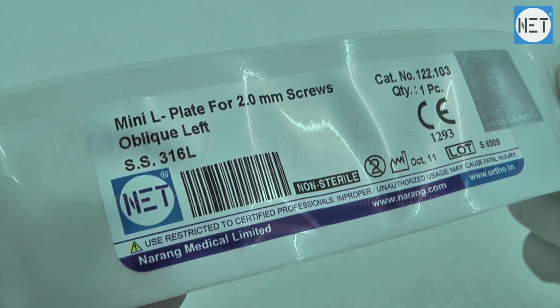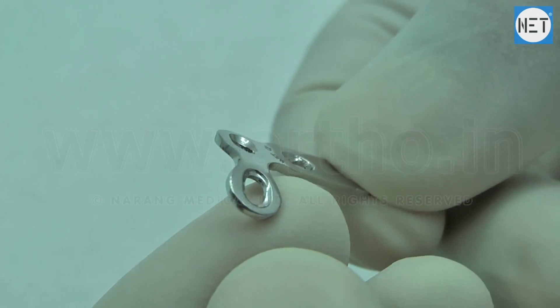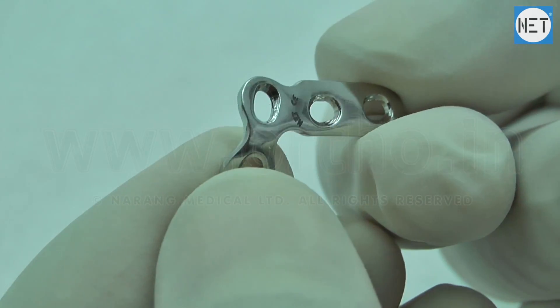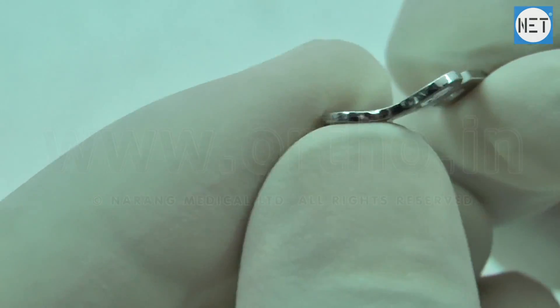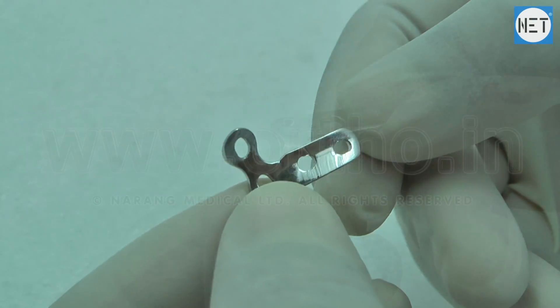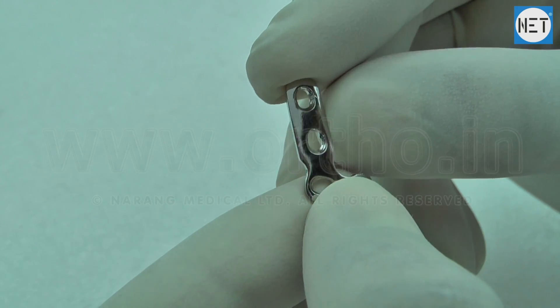Net brand mini L plate for 2 mm screws. These plates are used for proximal and distal extra articular, proximal and distal partial articular, and proximal and distal complete articular fractures of both hand and foot phalanges.